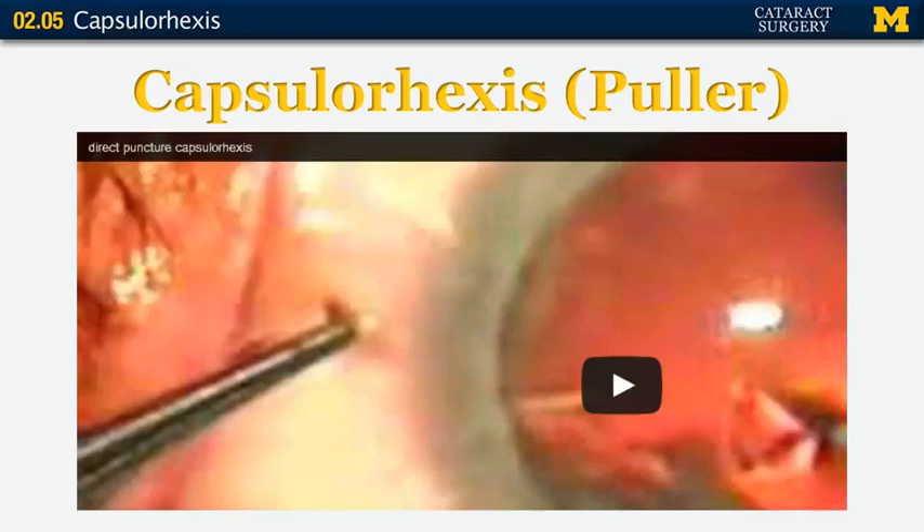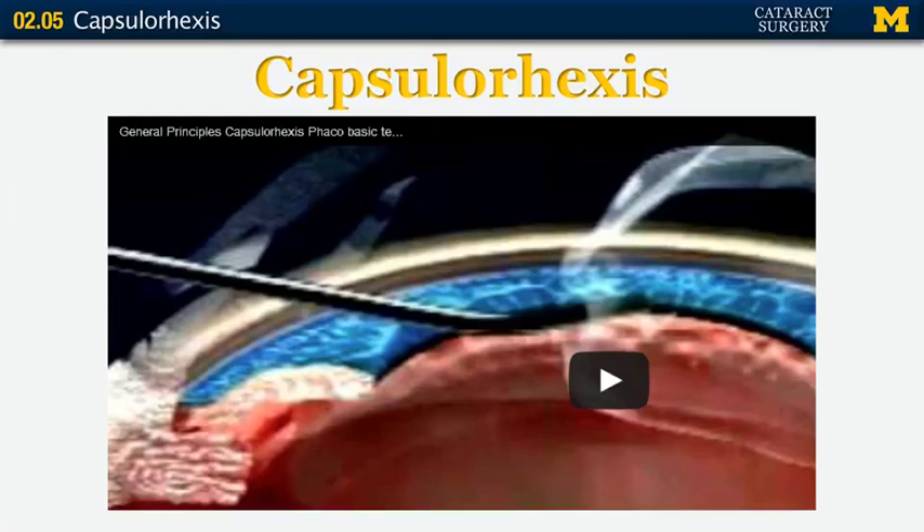Now let's talk about a video of someone who is a puller — this is a YouTube video you can watch on your own. This person actually leads the tear around the entire way with a cystotome. Again, just a different way of doing it — whatever you feel most comfortable with will work. This is an excellent, very comprehensive video that covers all the basic principles of good capsulorhexis creation, and it's important to watch.